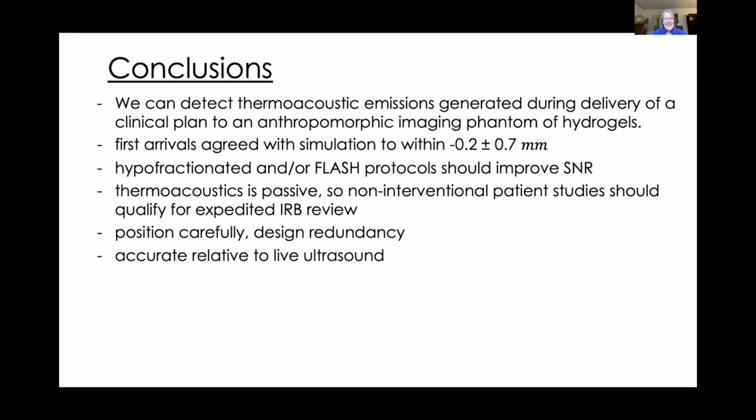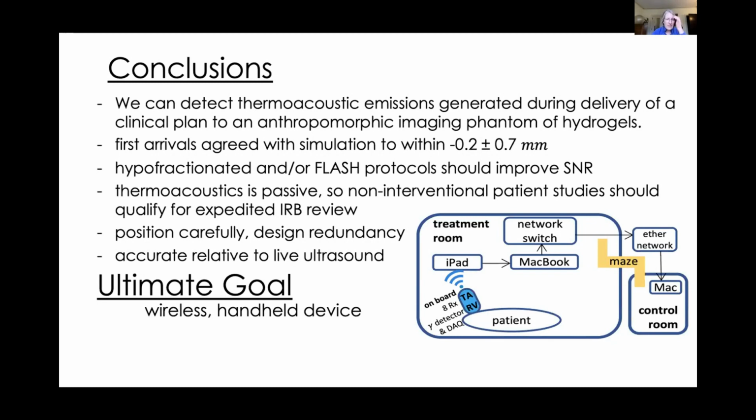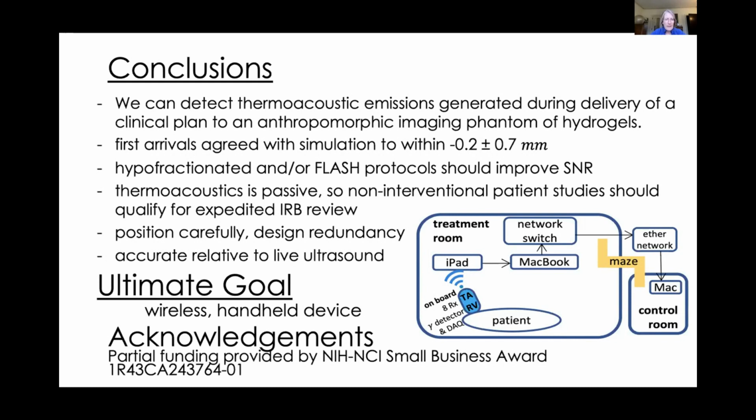Another point is that thermoacoustic imaging is passive, so getting studies going is actually relatively easy. We can do a non-interventional study and just listen for sounds without changing the patient care. And then the final point I'll make is that these results are really very accurate relative to the ultrasound images that we can acquire. Now, the ultimate goal and my pandemic project has been to take this very cumbersome system and make it more user-friendly. And this work has been supported by a SBIR award through NIH.